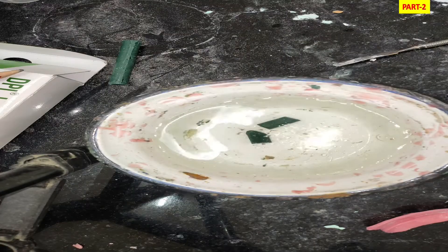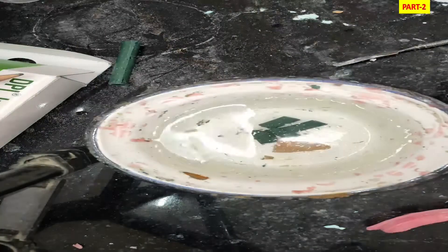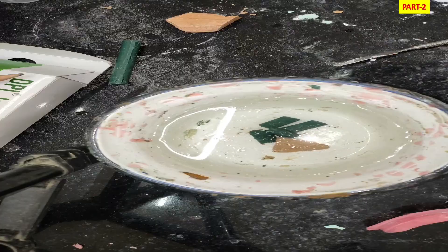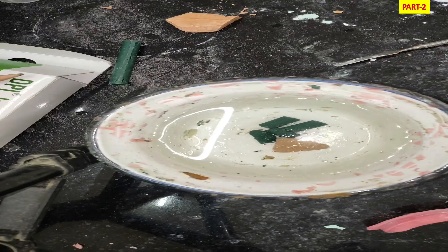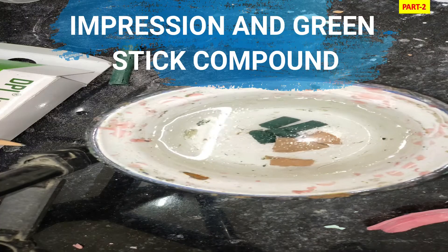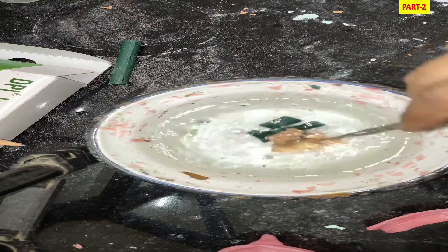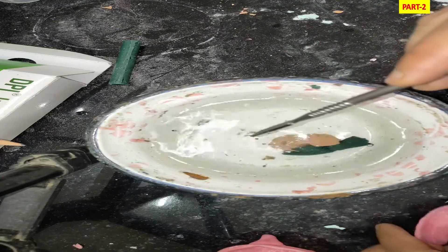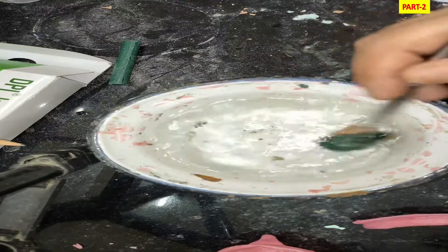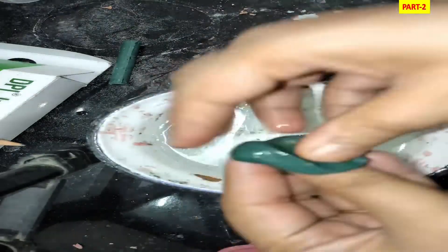Before starting the McCord technique, we prepare the admix material. Unlike the conventional method — where border molding is done with green stick compound followed by a zinc oxide eugenol wash — here we combine impression compound and green stick tracing compound in a ratio of 3:7 by weight. We use three parts impression compound and seven parts green stick compound, mixed in a bowl of warm water at 60 degrees Celsius.